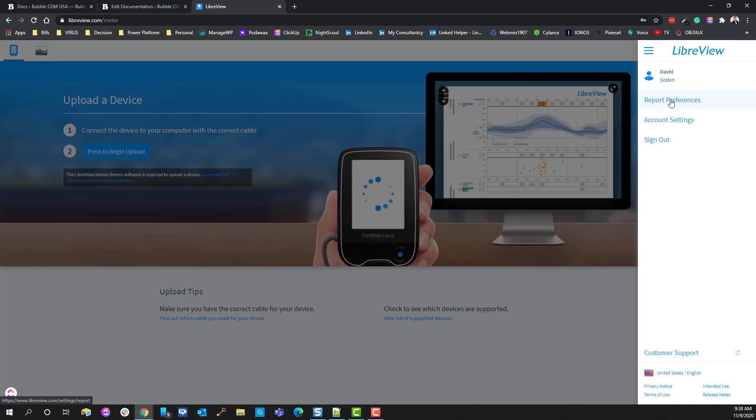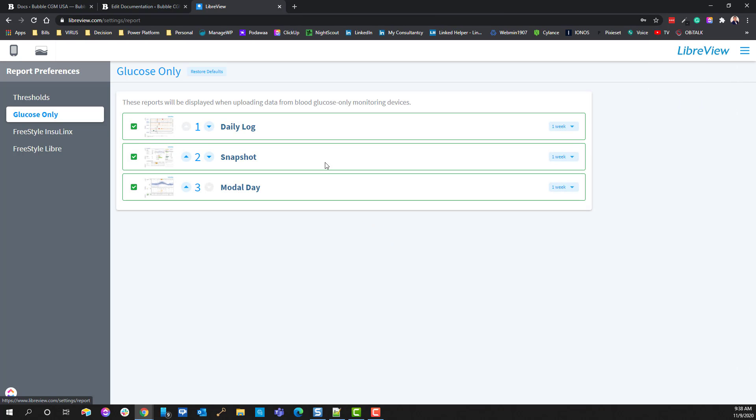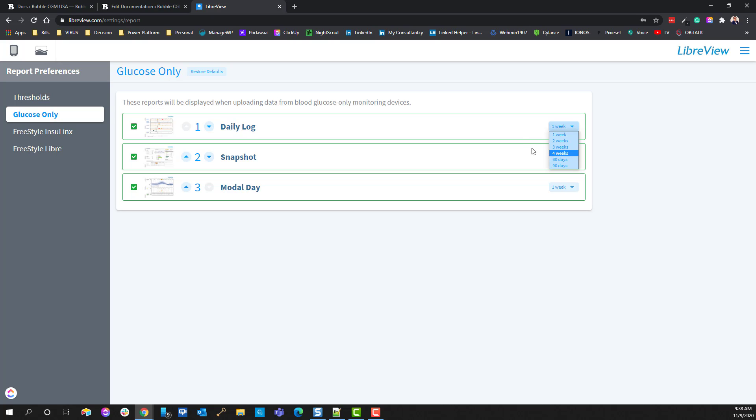So a couple things under this hamburger menu or settings menu. First of all, you have the report preferences. And if you haven't gone in here, you can change the particular report preferences to give you a report at one week, two week, three weeks, so on and so forth.